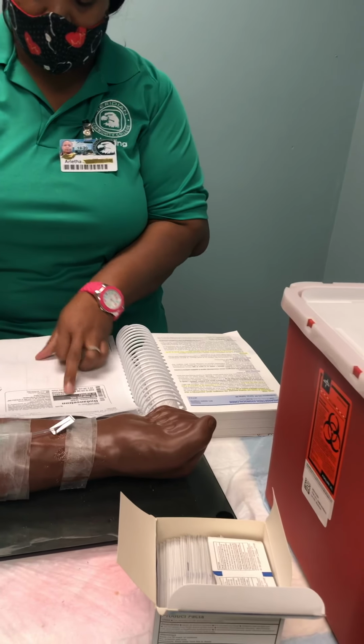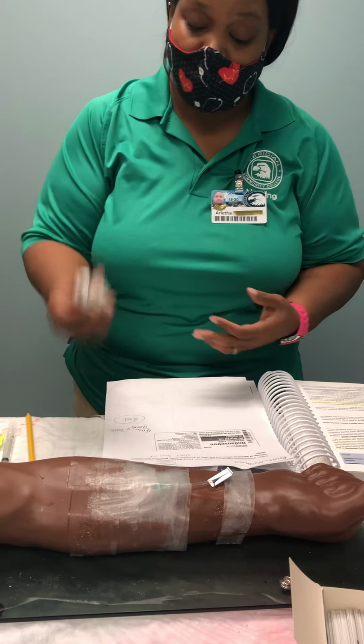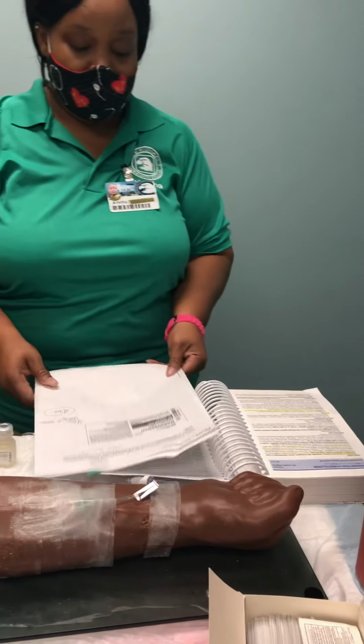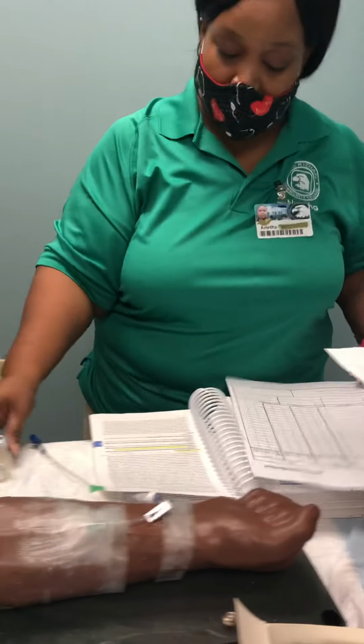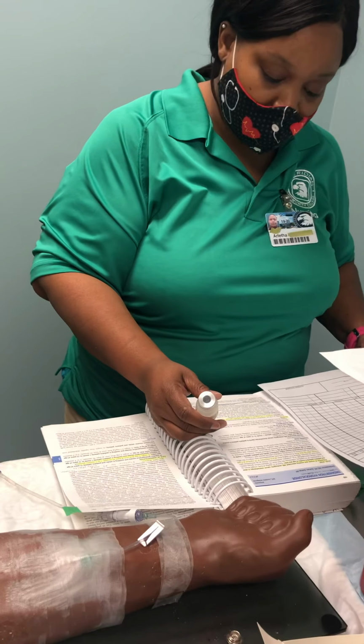Okay, I went on and did my math problem, and the bottle of medication has 40 milligrams over 20 ml. So I do my 4 milligrams divided by 40 times 20, and that gives me 2 milliliters. Okay, so I got my MAR and my medication. Zofran is for nausea and vomiting.